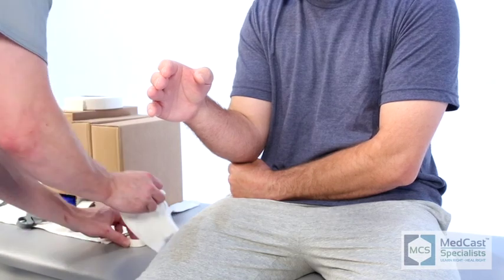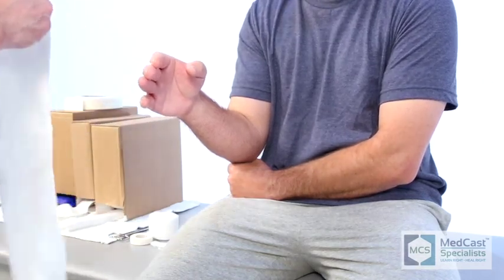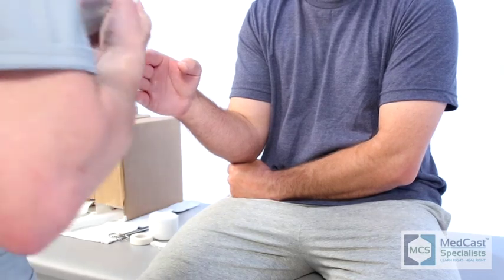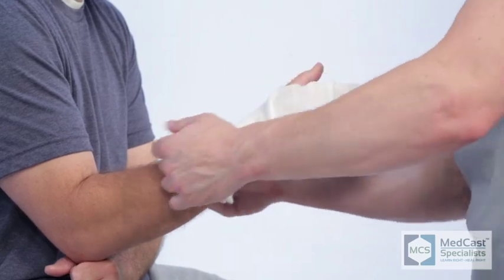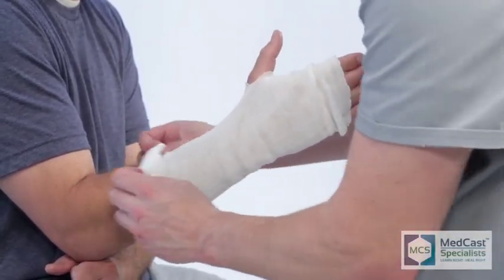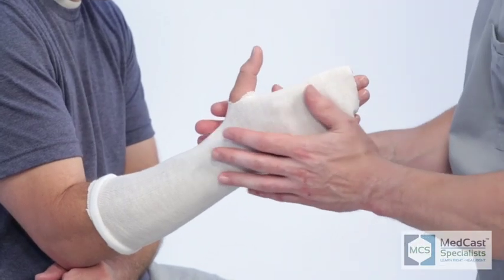This is probably one of the most fun short arm casts you can put on with the fingers incorporated — the ulnar gutter cast. A lot of people use splints during the duration of their fracture management, but a lot of physicians will request an ulnar gutter cast, especially if the patient is an athlete playing football or another sport.